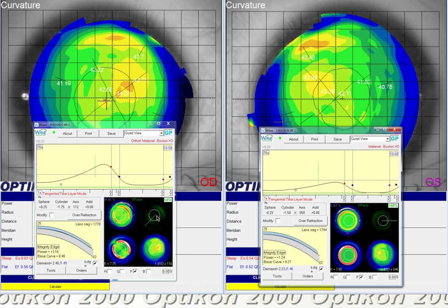So with this combination of oblique optics and internal astigmatism, sometimes we still end up with a case where the vision isn't very good, but this is how I would go about it, at least for the next step. We can still certainly learn from the case and hopefully contribute to this patient's quality of life through ortho-K as well. So those are my thoughts. Best of luck with your patient.